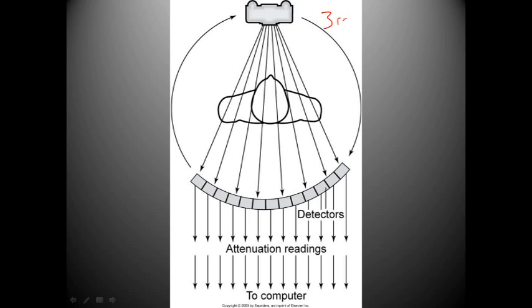Also, this is third gen in terms of scanning based on the detectors. But we see fan beam or the cone beam. Basically, the photons are being emitted through the patient. Some scatter is going on, and ultimately the detectors are catching all of the radiation.